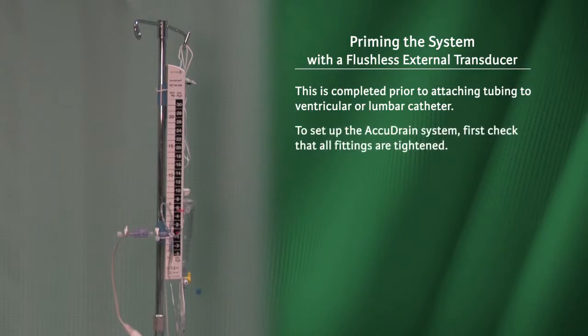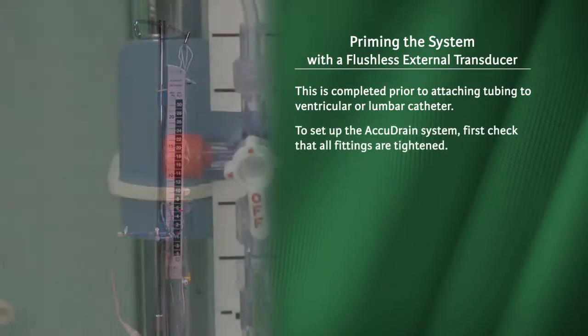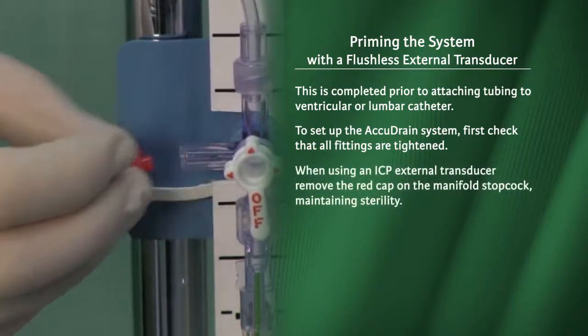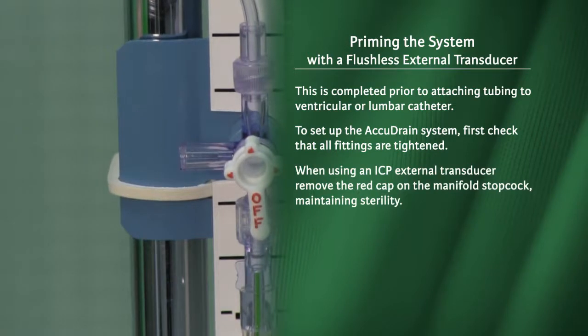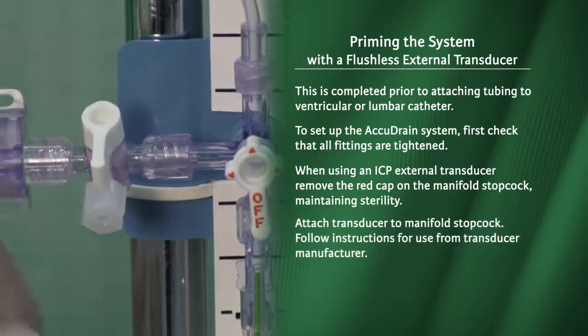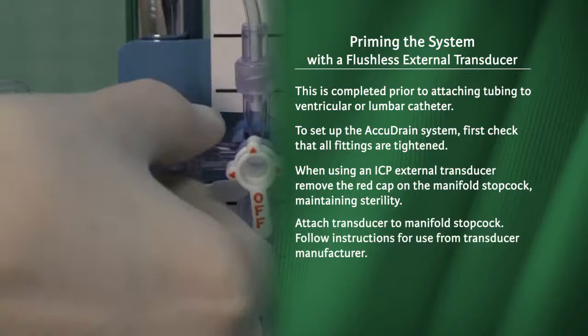To set up the AccuDrain system, first check that all fittings are tightened. When using an ICP external transducer, remove the red cap on the manifold stopcock maintaining sterility. Attach the transducer to the manifold stopcock. Follow instructions for use from the transducer manufacturer.